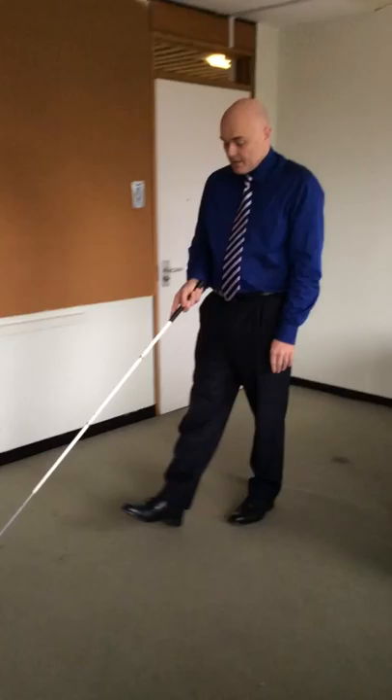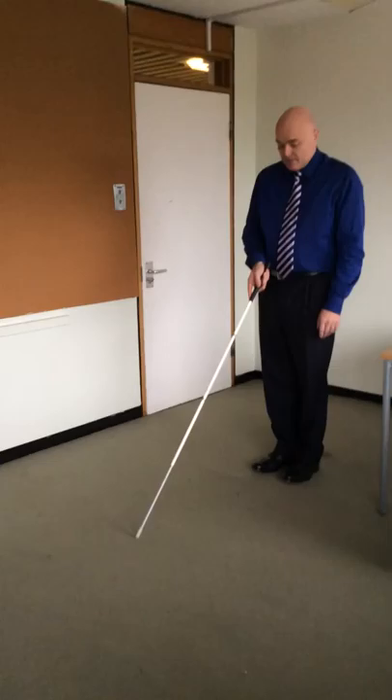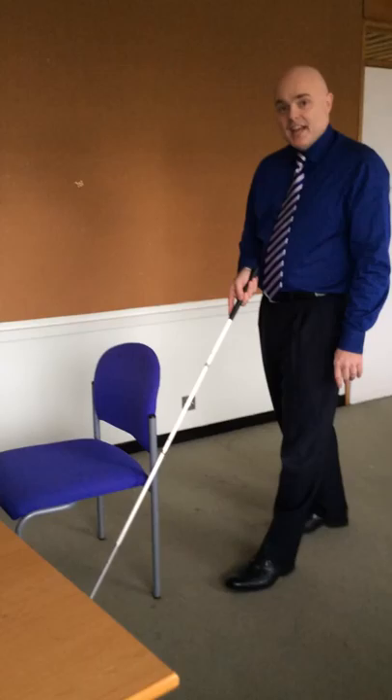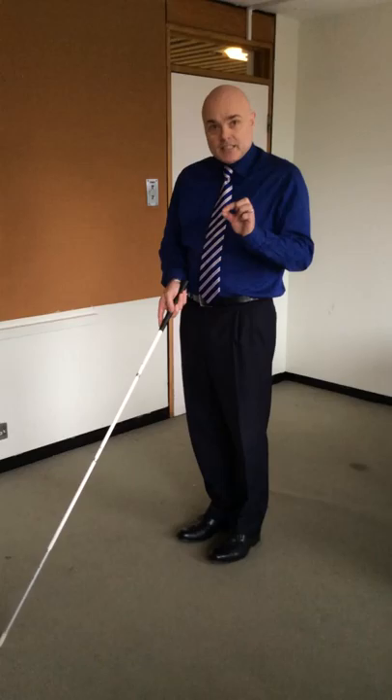If I walk forward out of step, we'll see what happens — I walk into the chair. However, if I'm walking in step, walking correctly, my cane finds the chair before I get to it. It's a simple thing, but that's why we need to make sure that our clients walk in step when using the cane.